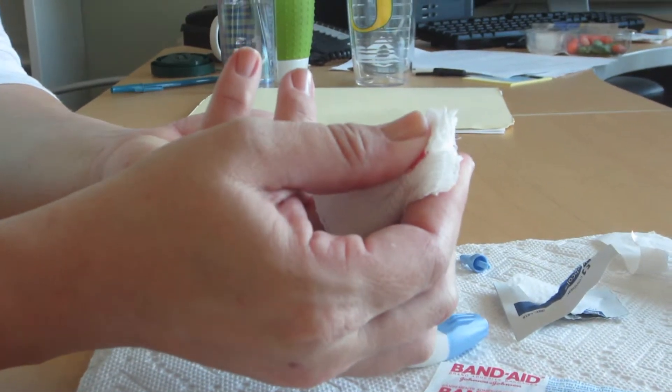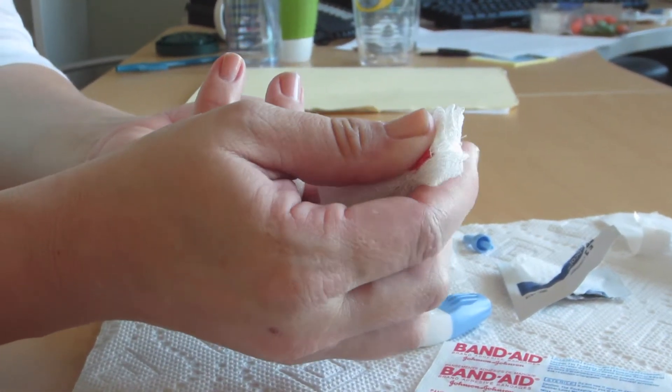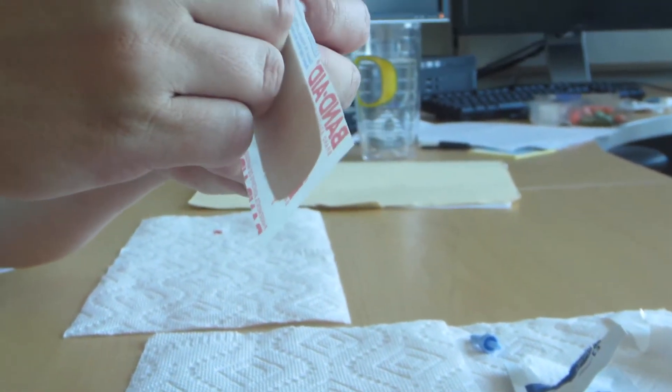When finished with the sample, place a gauze pad on the pricked finger and apply pressure to stop any bleeding. Once bleeding has slowed, place a band-aid on the pricked finger.